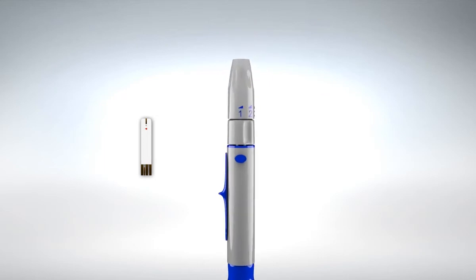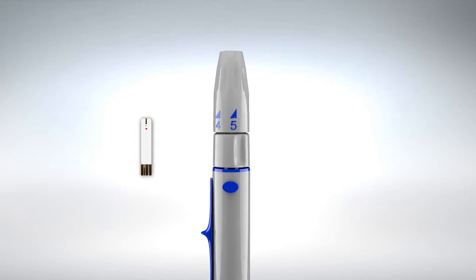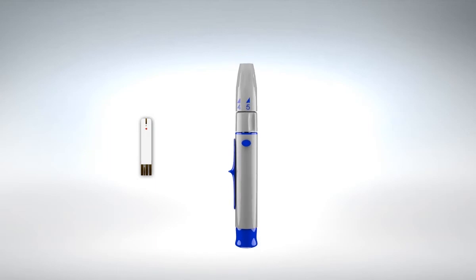The lancing device offers five different settings. Turn the upper top of the lancing device to the desired level, 1 through 5. Level 1 is the shallowest depth and level 5 is the deepest. Now you are ready to proceed with the glucose level test.